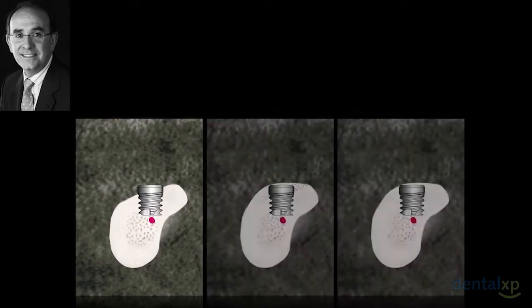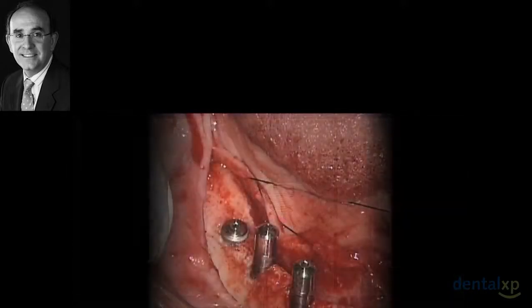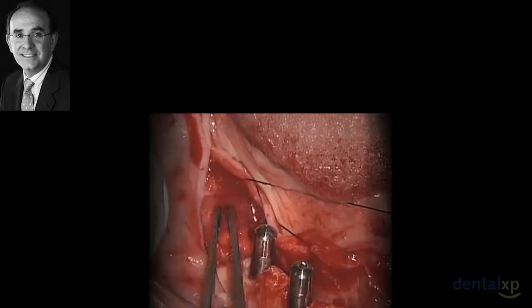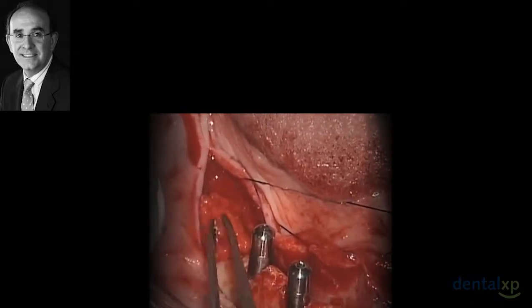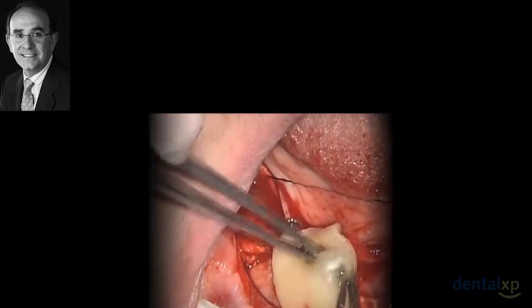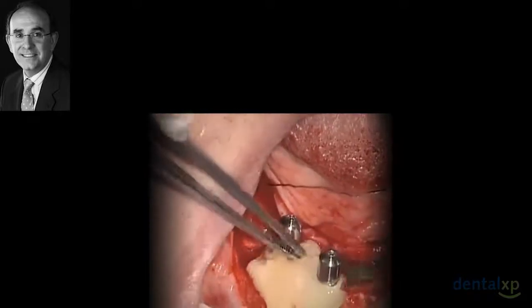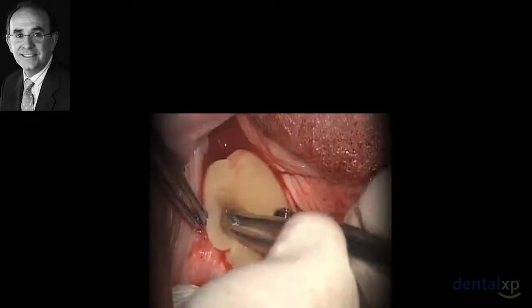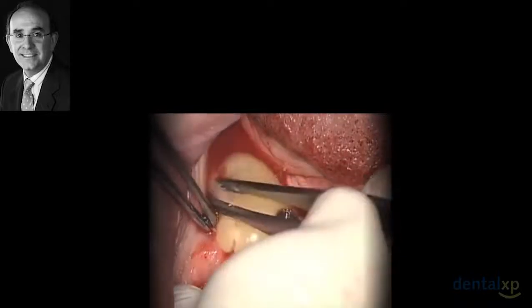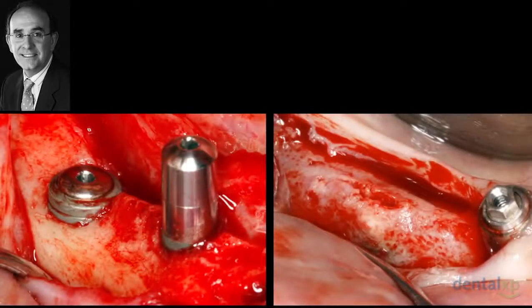After that, with the bone that you recover drilling, you can obtain vertical growth exactly the same as we obtain in the upper maxilla. Let me show you exactly the approach. This is the bone that I recovered drilling in a clot of PRGF. The advantage is that the proteins are sticky. You can place the graft exactly in the position, and after that, I cover only with a fibrin membrane. And after that, you can suture, and this was the result that we obtained.